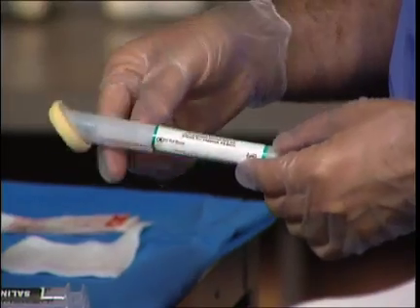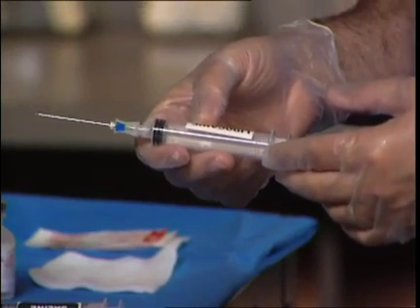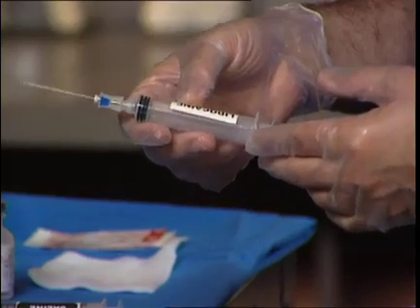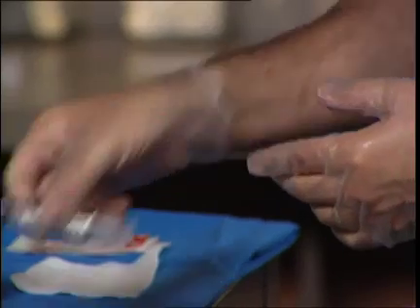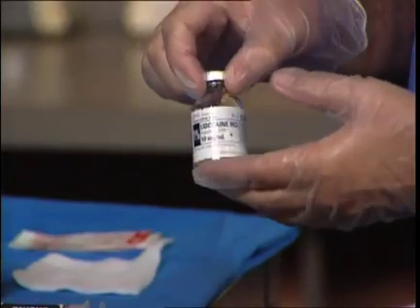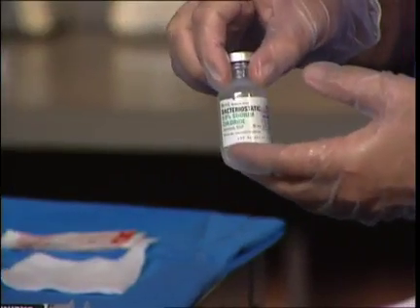In order to facilitate a proper block, the following equipment is required: a chlorhexidine prep for sterile technique; a local anesthetic syringe with a 27-gauge, 1.5-inch needle for local anesthetic placement, preferably 1% bicarbonated buffered lidocaine; and a syringe containing the epidural steroid mix, which is composed of 1 cc of 1% lidocaine, 6 cc's of bacteriostatic saline, and 40 to 80 milligrams of Triamcinolone Kenalog, which is a particulate steroid.